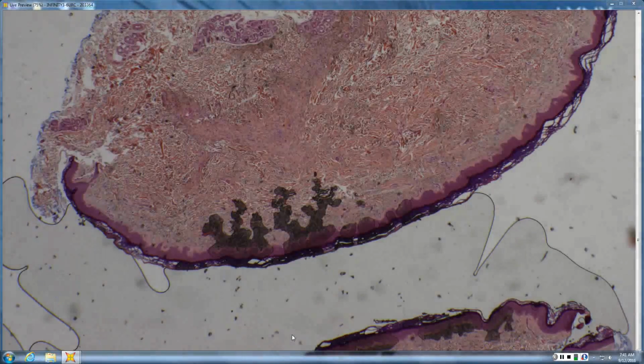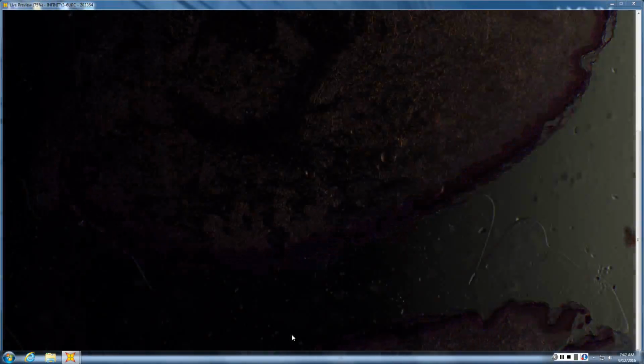And at a glance, when you're having trouble and you don't know if the stroma is just trapped collagen or newly synthesized, that helps, because the blue nevi tend to black out. And they don't mature, and they don't disperse, and they don't have a gradient with HMB 45. That's just their nature.